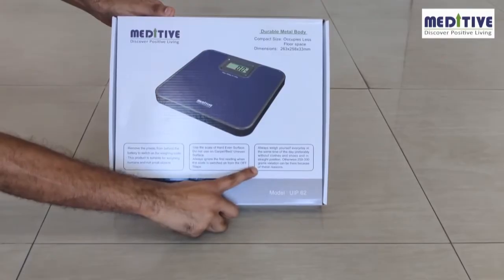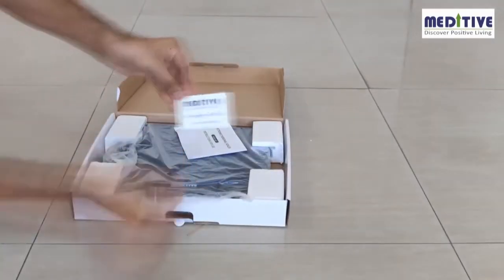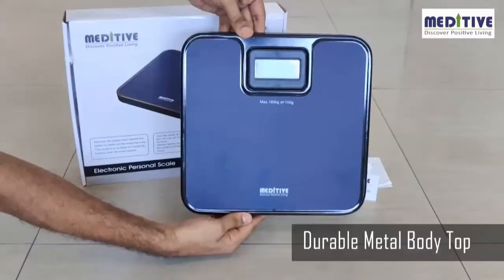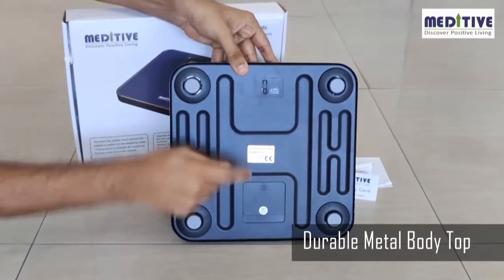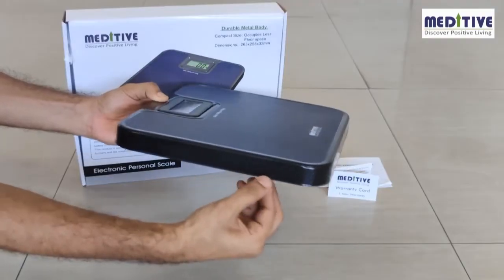The Meditive human weighing scale is designed using a durable metal body. Please read the instructions on the box and the user manual to understand the product and warranty. The scale has a strong platform and base, so there is less chance of breakage unlike the usual glass body scales.